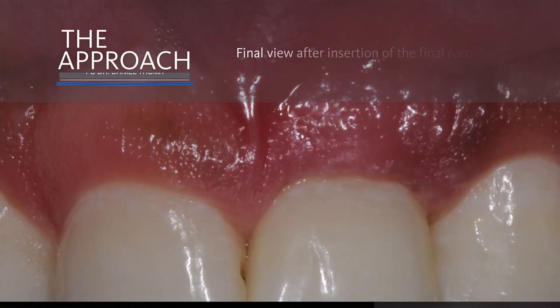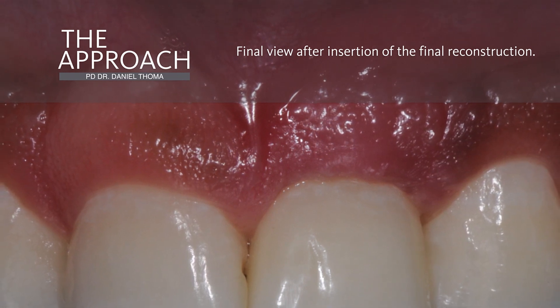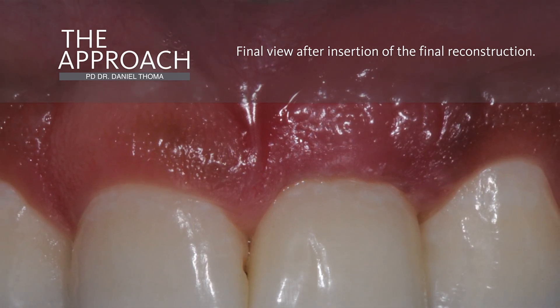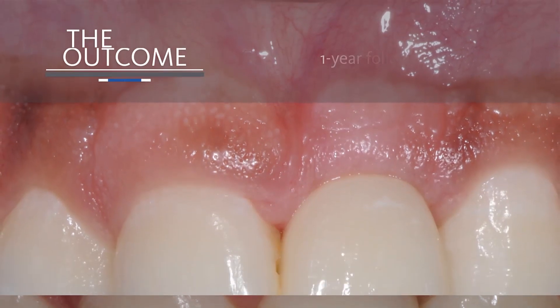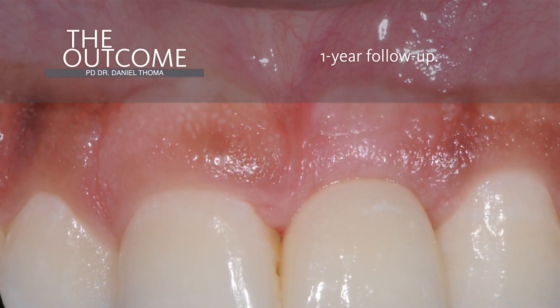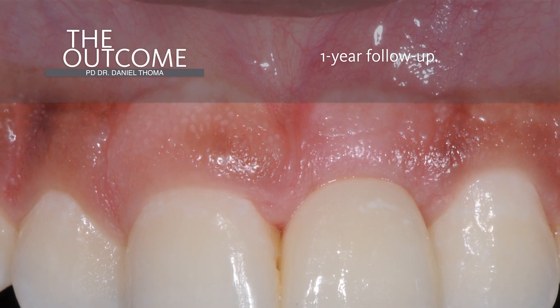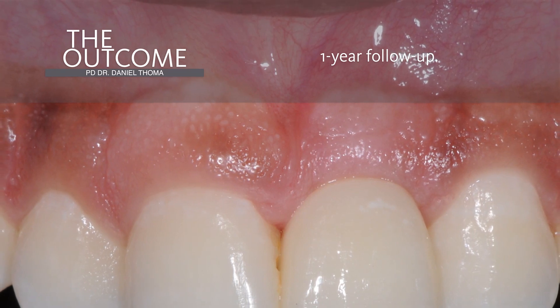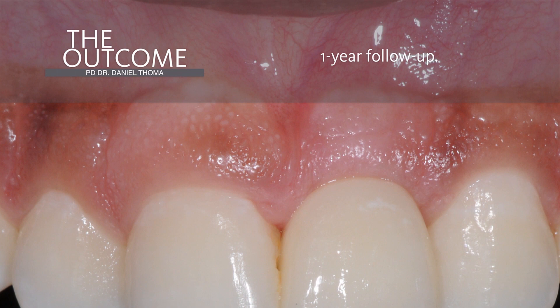Finally, we take a final impression and insert the final implant-borne single tooth reconstruction made with a zirconia abutment and directly veneered ceramics. The final view, one year after insertion of the final reconstruction, shows very pleasing aesthetic outcomes. The patient is happy and the peri-implant tissues are healthy, with no bleeding or probing observed.